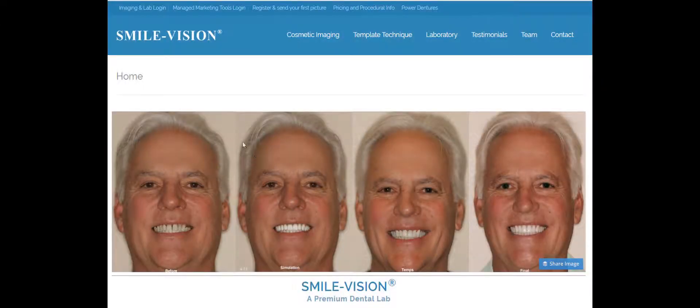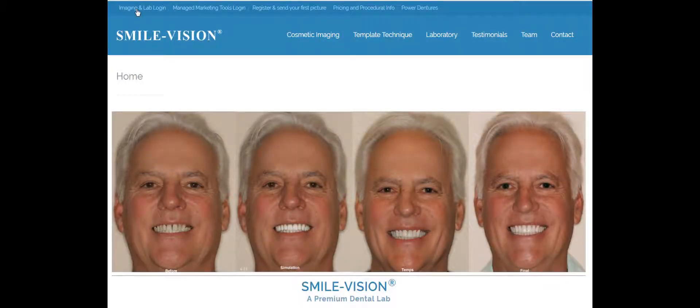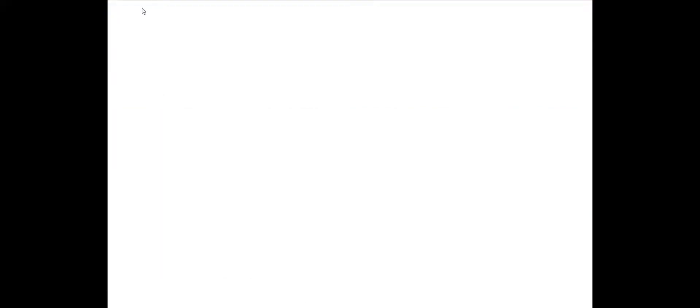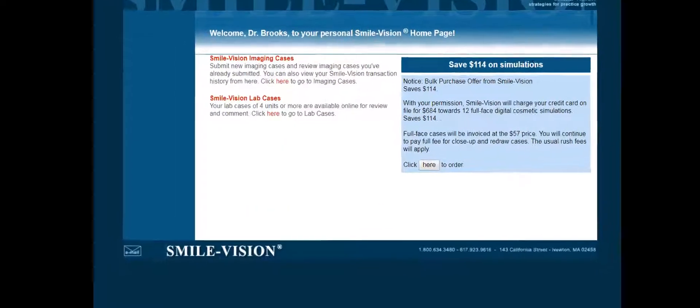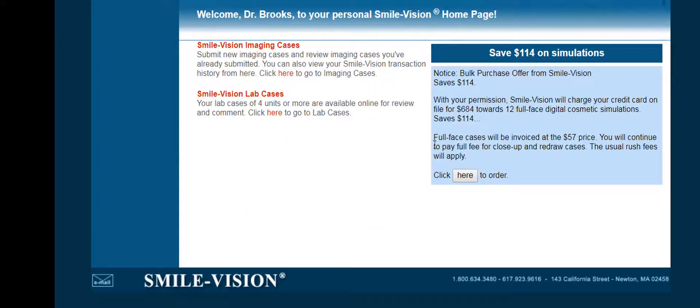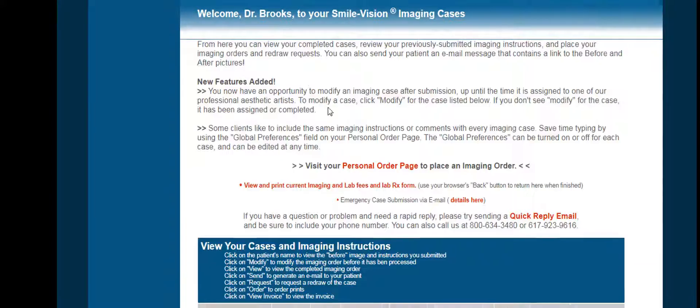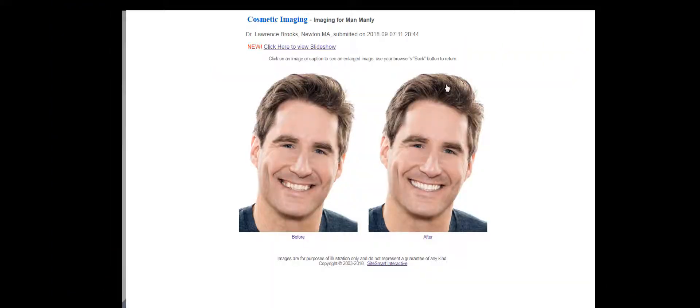You may show before and after side-by-side or enlarge the images or use the slideshow mode as I'm doing here.